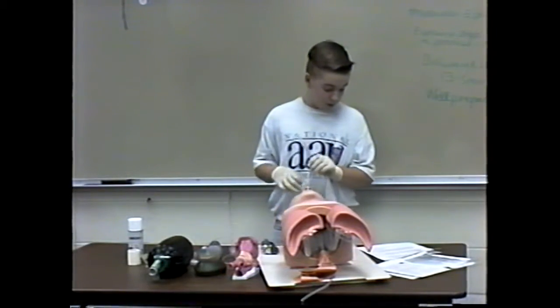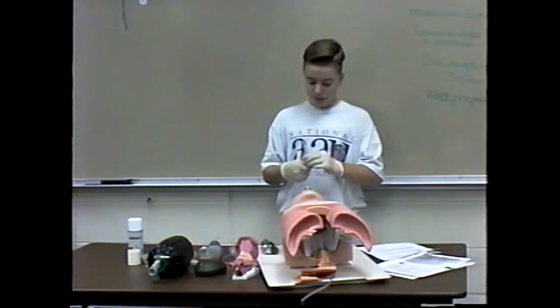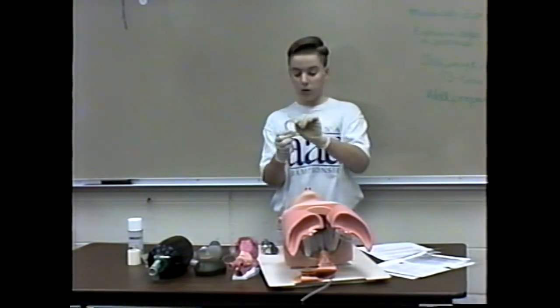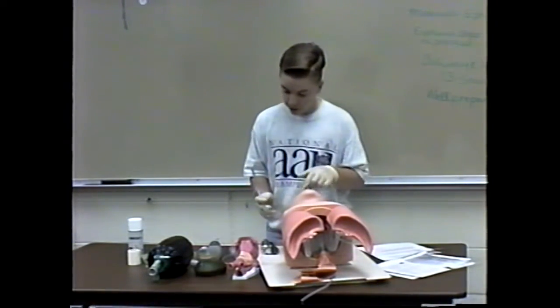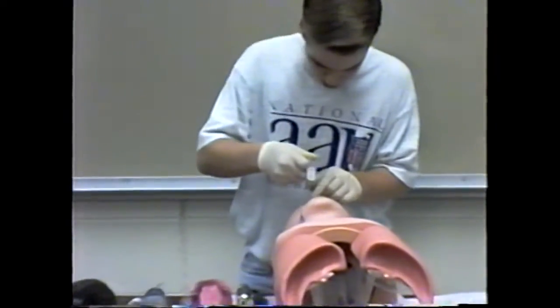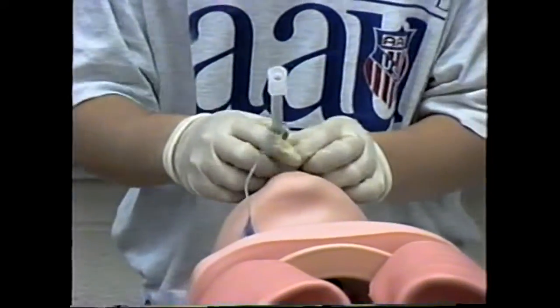Inserting the nasal, you roll the tube up into a little ball, or little circles like this, to form the shape of the nostril. Again, you would hyperventilate the patient. The tube goes down either nostril, it really doesn't matter.